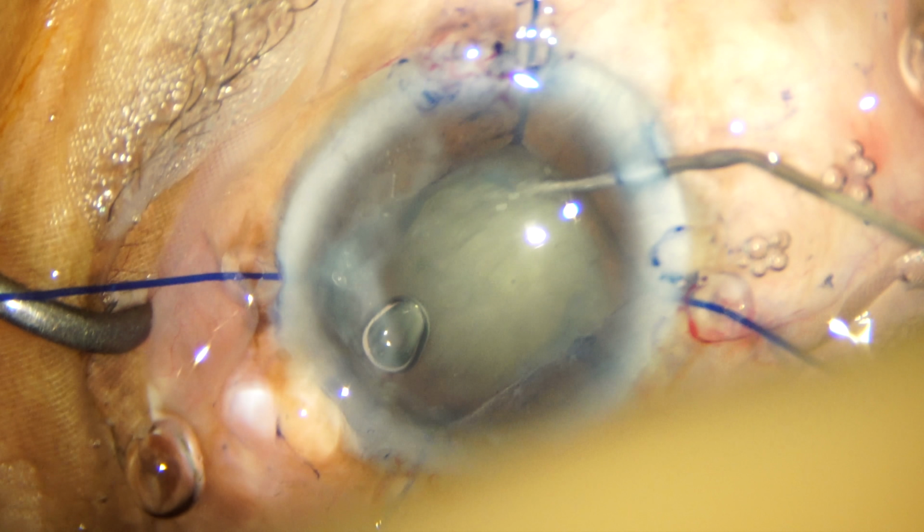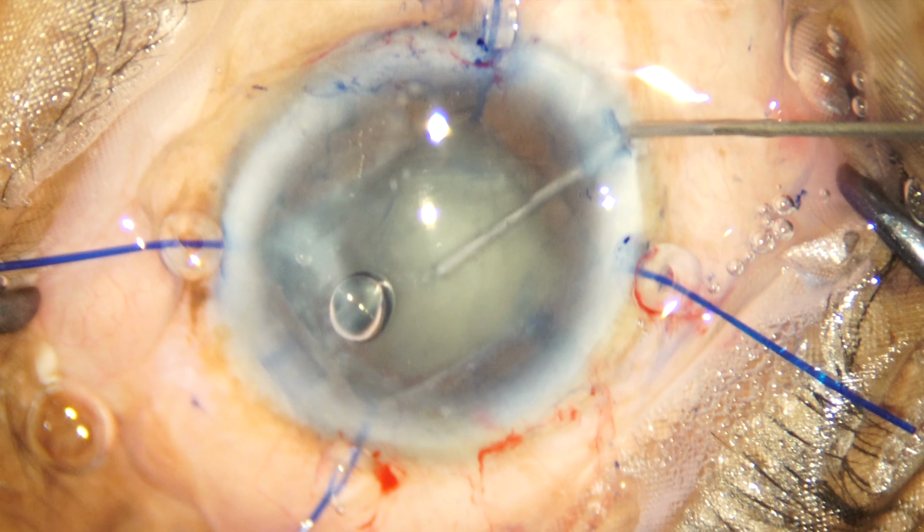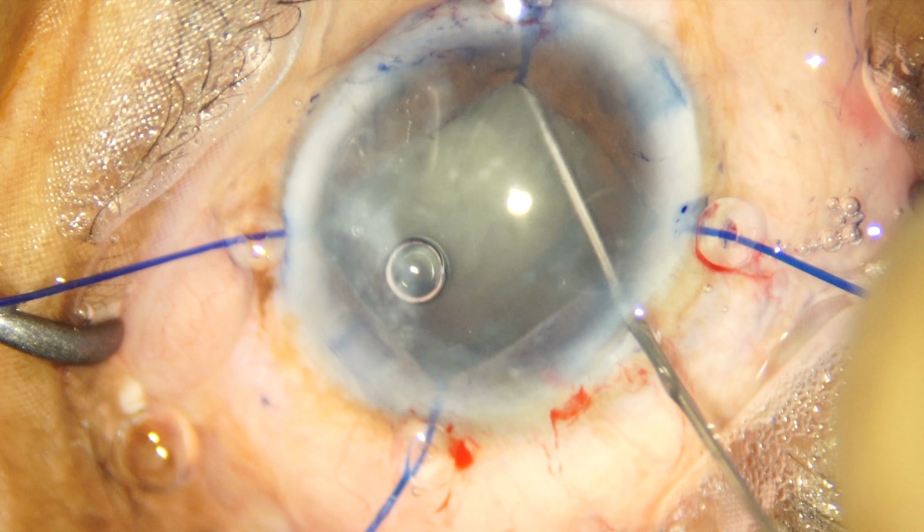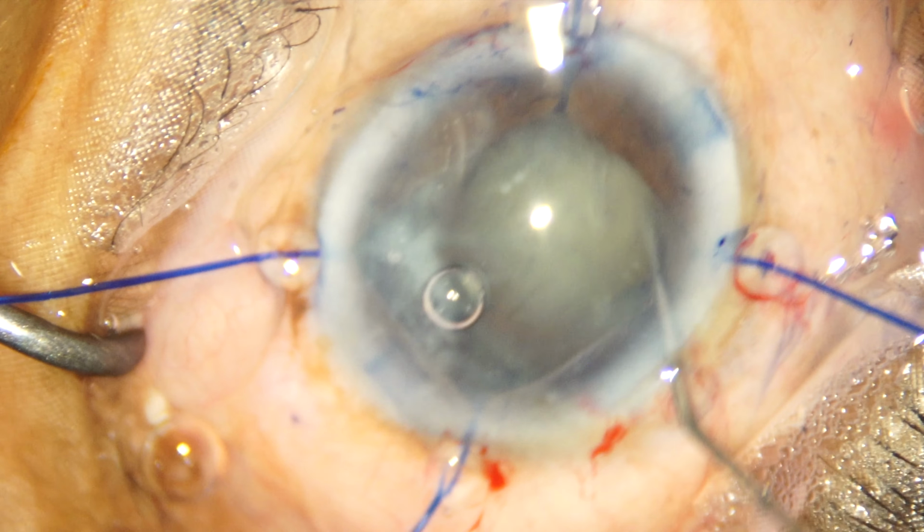Hydrodissection is completed and nucleus rotation is achieved very gently so as not to exert any extra pressure on the weakened zonules in pseudoexfoliation.